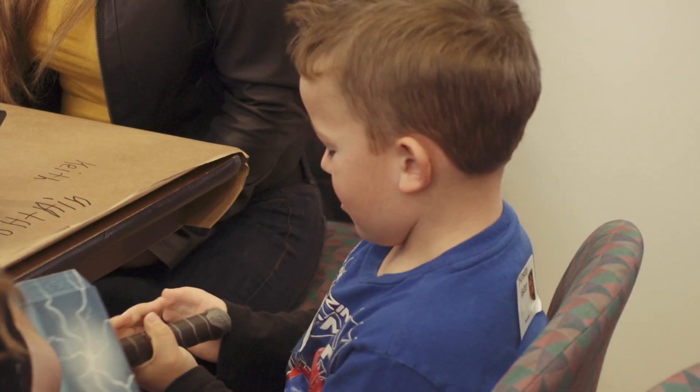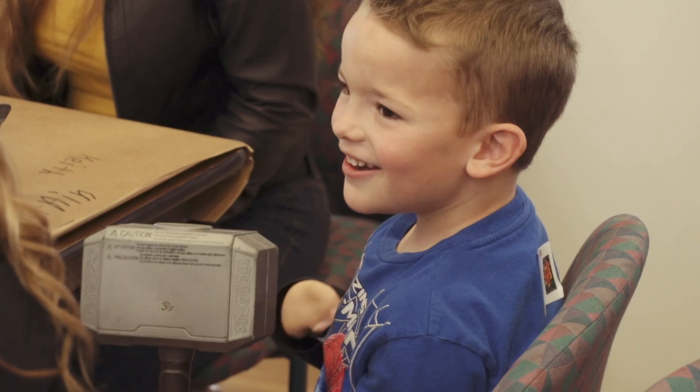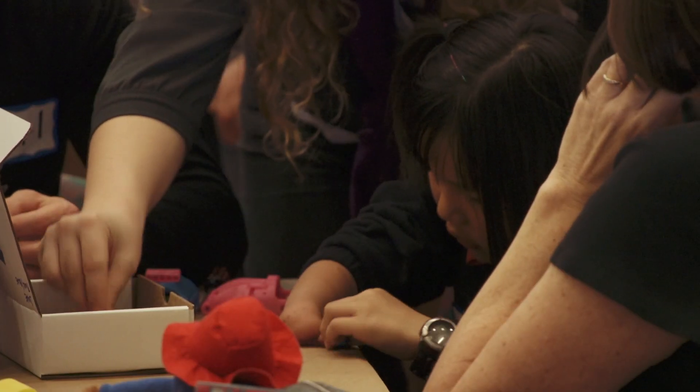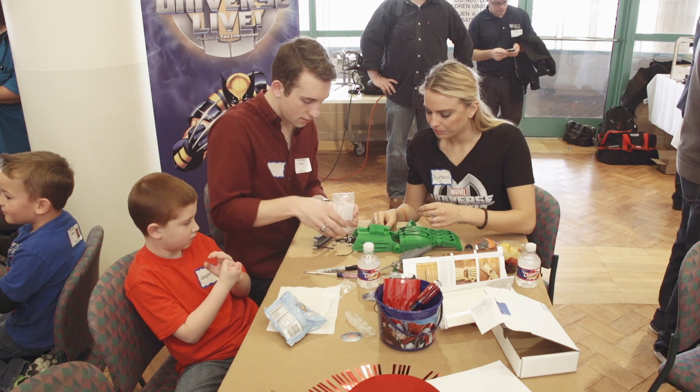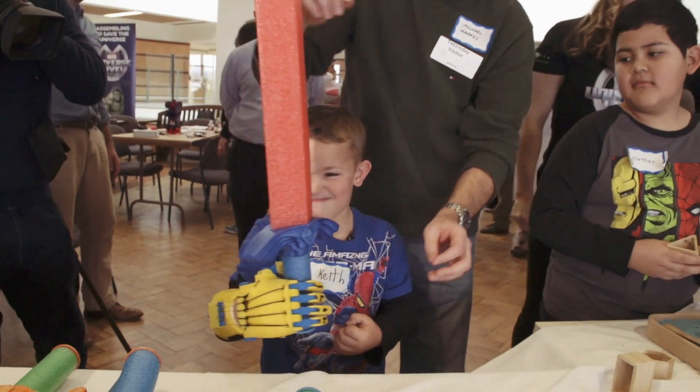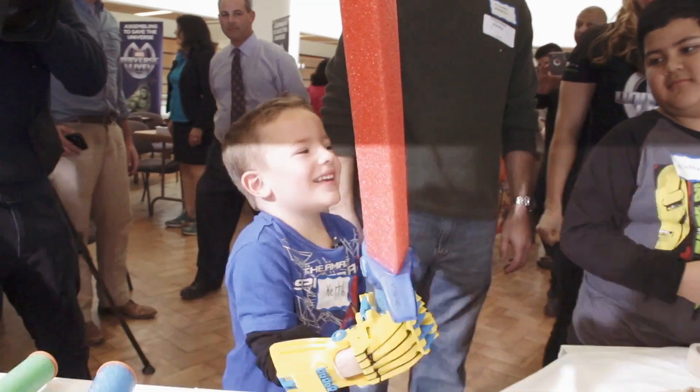So these are all kids who have limb reductions, meaning that they were born without a part of their hand. You can be born without any part of your hand, below the elbow, above the elbow. But this particular group of kids right here have a little bit of a wrist and no hand at all — no thumb, no fingers, nothing. So they can't hang on to stuff. Imagine not being able to hold a water bottle to get the top off, or hold your bike so you can ride it. It's actually pretty significant. All these kids have spent their life not being able to hang on to things, and that's what we're able to give them today.